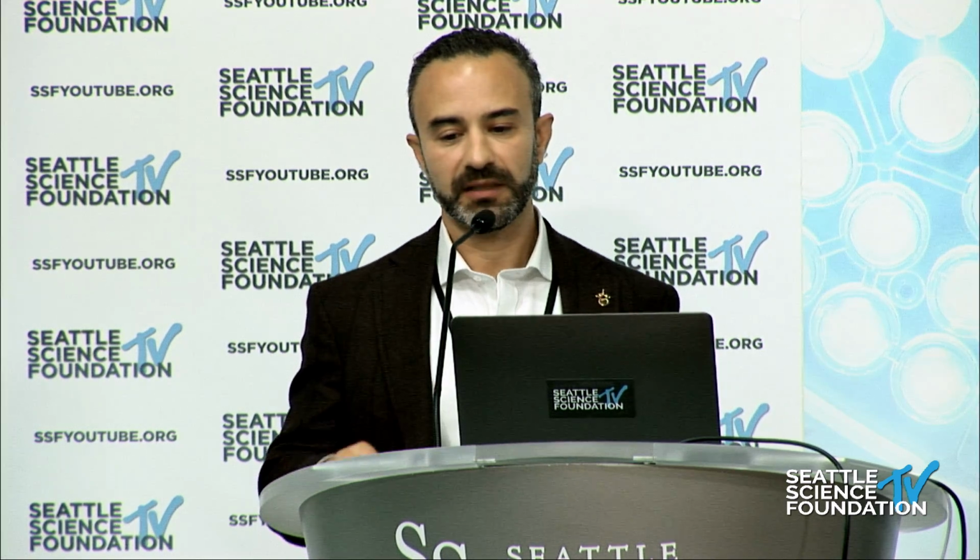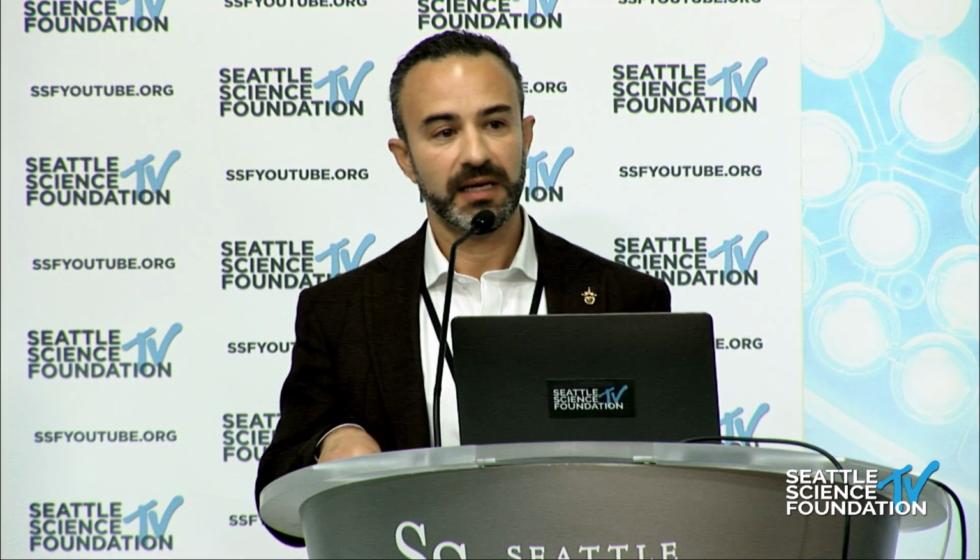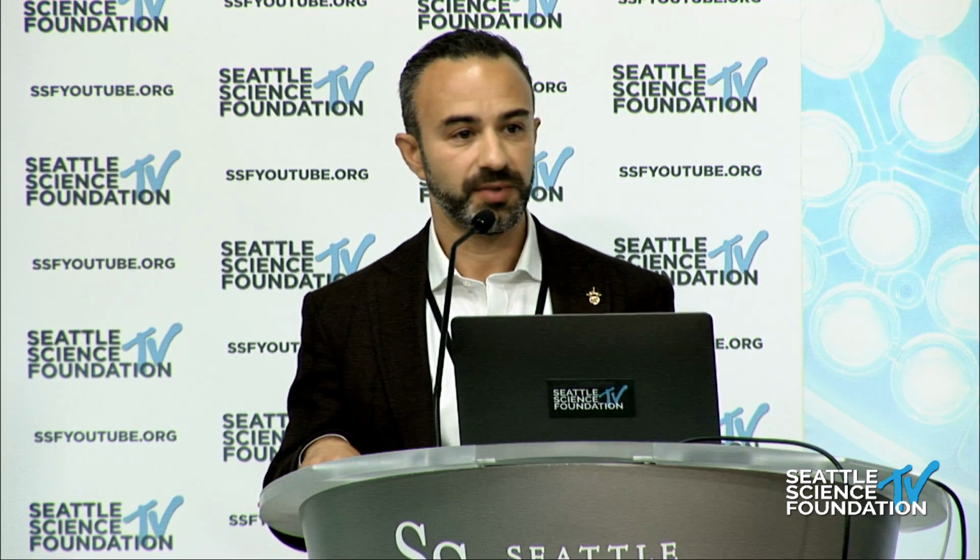However, in general, when I'm performing revision surgery, patients get DEXA scans, and they also get a CT scan. I'm always looking at the Hounsfield units at UIV +2, UIV +1, my UIV and below to see what those averages are. Paul Anderson has a really good paper out on that.